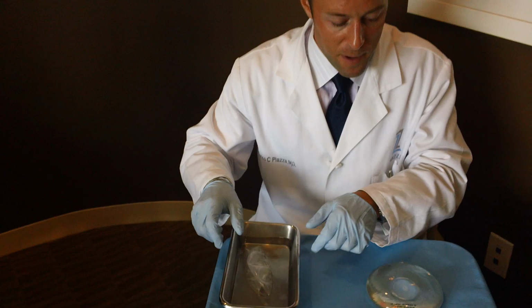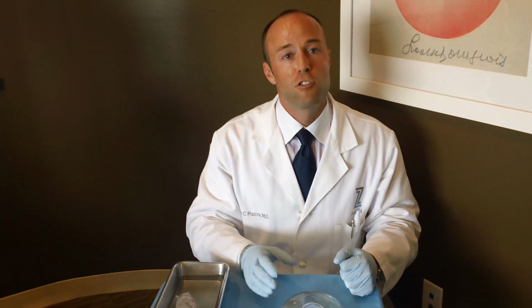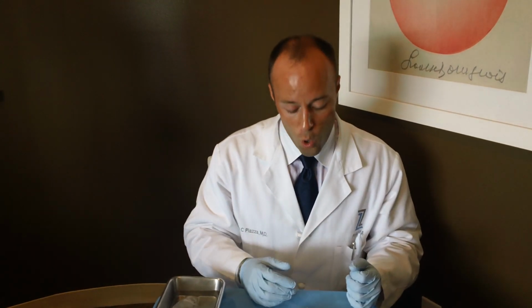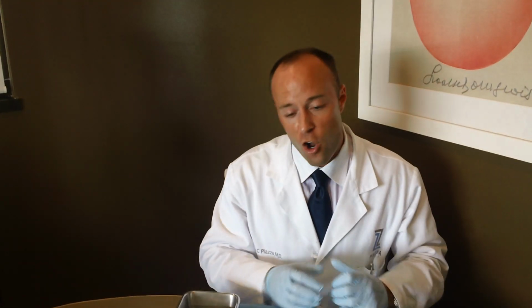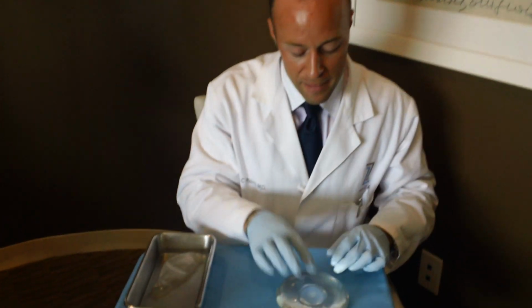Now let's talk a minute about silicone gel breast implants. This is our newest generation or most modern generation silicone gel breast implant. These are also known as either the gummy bear or the more form stable type implants, as the gel is really a little bit thicker than it was before. It all has to do with cross-linking of the silicone itself. So the outer shell is similar to that of a saline implant. It is a silicone elastomer shell, and the inner silicone is a lot different than it was previously.